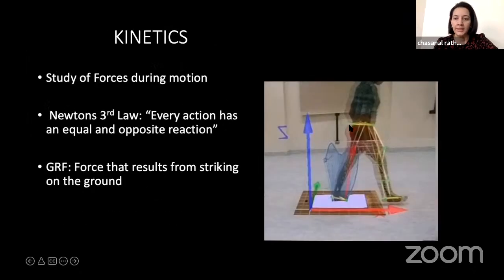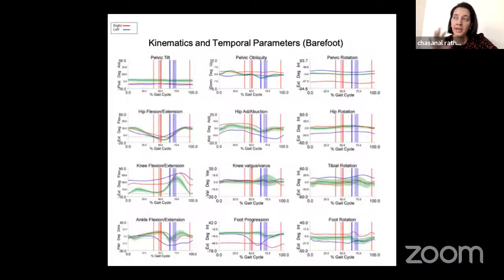Okay. Yeah, and the kinetic is, every time in the stance, when the heel strikes the force plate, we get what amount of forces are being generated. So when the child walks in an equinus, the ankle forces are not generated the way they should be. So it gives us an idea how fixed or how dynamic the equinus is and how much problem is happening at that particular joint level. So this is typically what a gait report looks like.